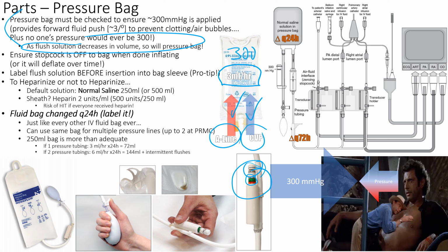That way, if the air tries to leave, it's going to come down and hit that off switch right there. If I kept the off switch in its neutral position, off to the left over here, or off to the side, then it will slowly leak back into the cuff right here and out the hole at the bottom, right? So then you're going to lose pressure in your bag. So we want to make sure that we have our switch turned off to the bag, right? If I kept it just facing that way like you did by default, all the air would just kind of leave the bottom hole right there.